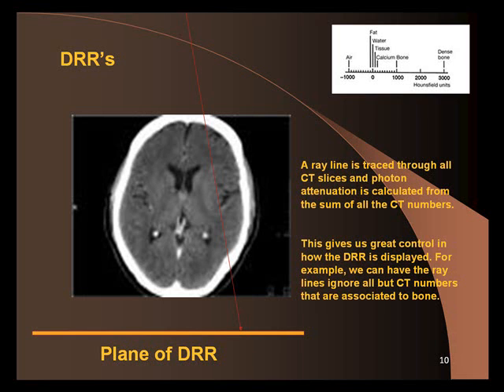a basic radiograph: here's an X-ray tube up here, so you've got the anode up here and filament, and you've got your patient lying down, and then you've got a piece of film. This is a patient, by the way. Okay? And it looks like a dog, but it's a person. And the X-rays come down, and they irradiate the patient, and you get what we call a transmission radiograph.